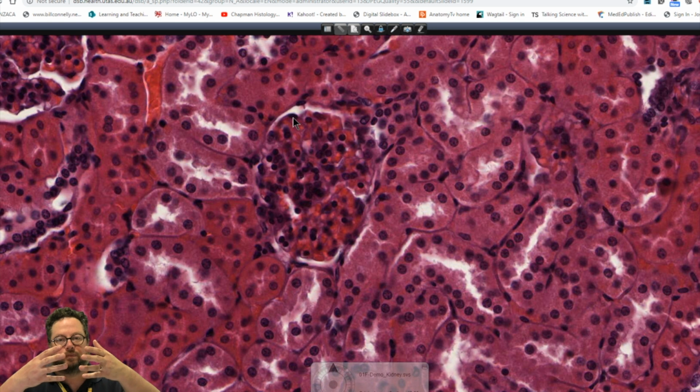They envelop and wrap around the capillary loops themselves, and they're sort of like Homer Simpson grabbing onto Bart Simpson's throat, like, "Why, you little?" And so Homer's fingers wrapping around Bart's neck are the foot processes of the podocytes, and these are known as pedicels. And so the pedicels envelop the blood capillary.